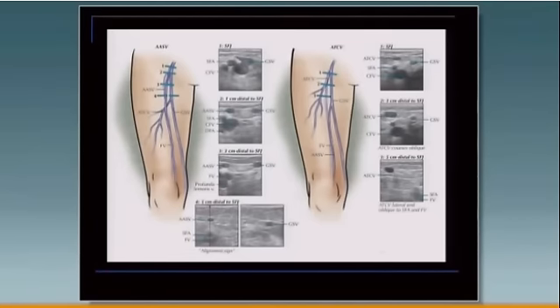The circumflex vein, however, since it travels obliquely, you see here it's originally aligned with the femoral vessels, and as one scans down it drifts off laterally. Here's the deep vessels. Here's the circumflex going oblique.